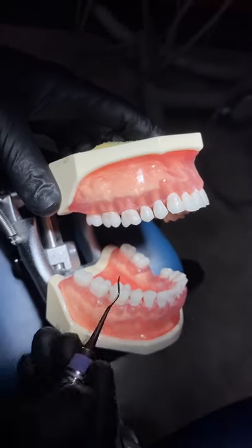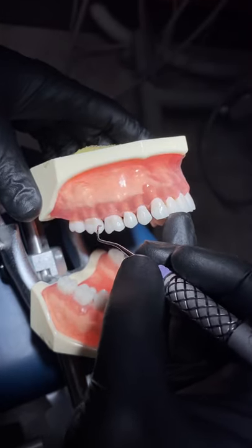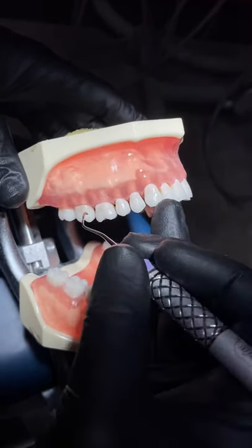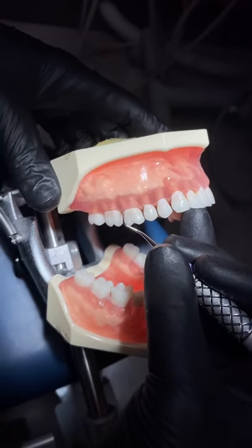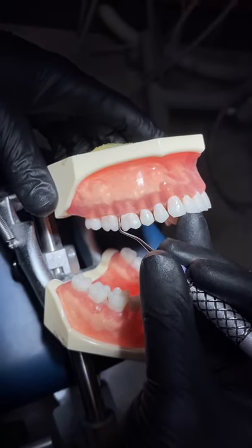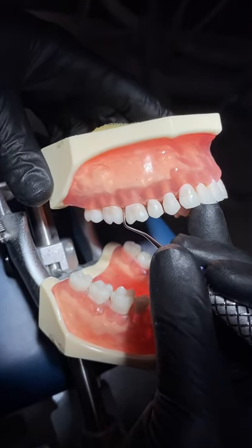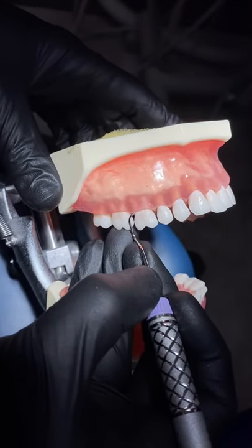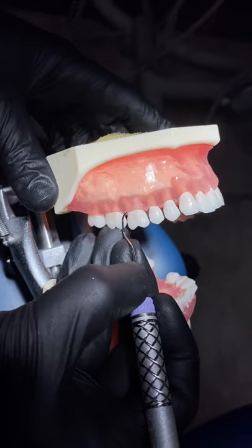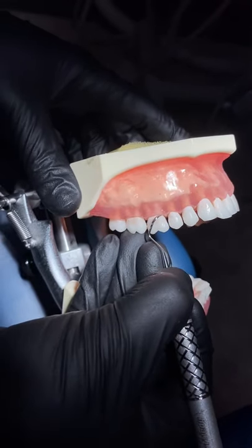Just as when instrumenting with our Explorer, we're going to start on the distal buccal line angle. Make small controlled working strokes. Then for the mesial, we'll again insert at the distal buccal line angle and work our way across.